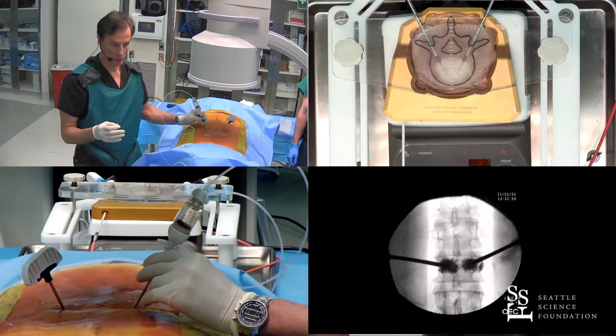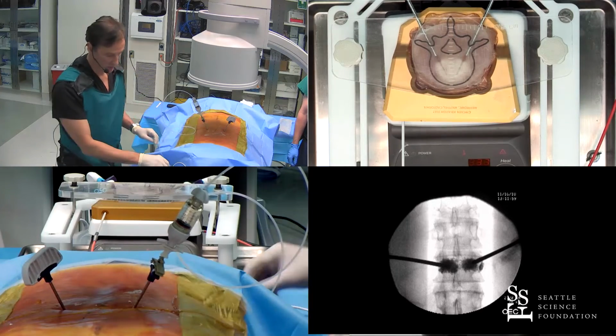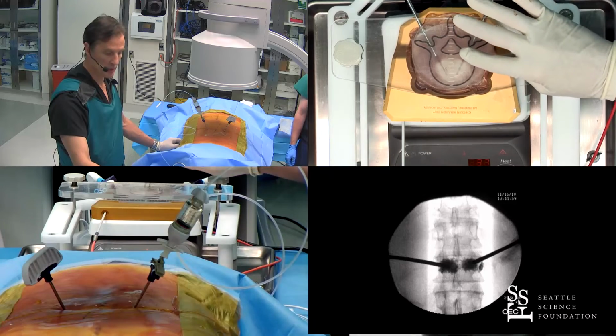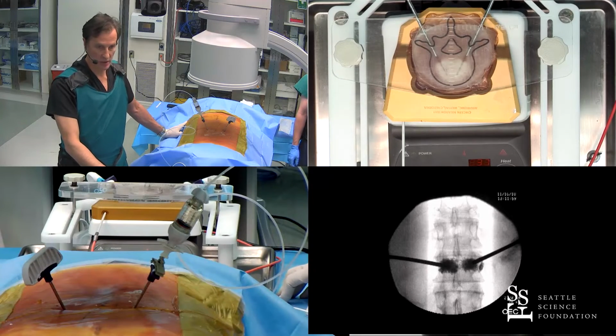And so radiofrequency ablation followed by balloon augmentation kyphoplasty, and then the ablation zone is demonstrated to be the shape of the vertebral body within the confines of the vertebral body, and our chicken breast demonstrated this very nicely.